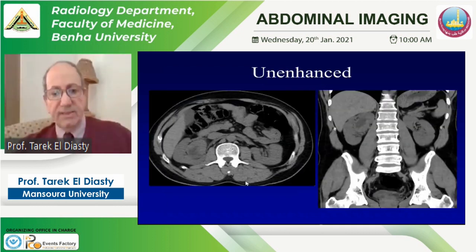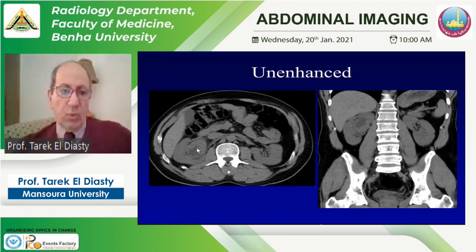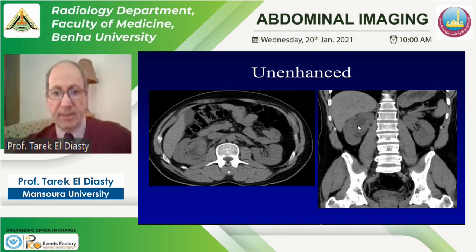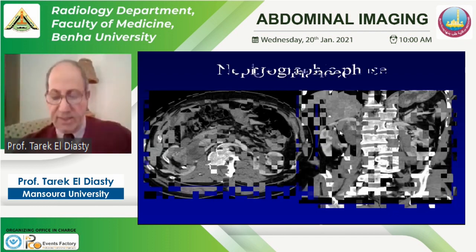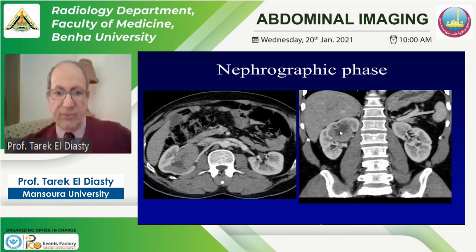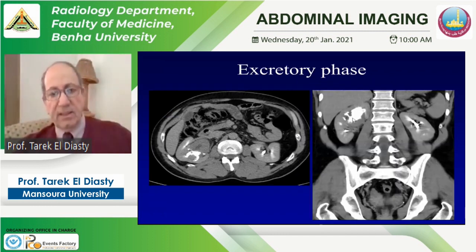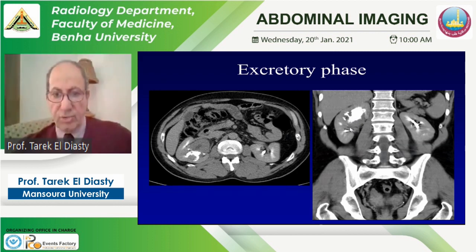An example of CT urography in a patient with hematuria: on enhanced CT, an irregular soft tissue lesion in the region of the renal pelvis shows enhancement with areas suggesting cystic degeneration. In the nephrographic phase, and at the delayed phase, there is erosion and irregularity of the related pelvis and upper caliceal infundibulum — a case of a renal pelvic transitional cell carcinoma demonstrated across typical CT urography phases.